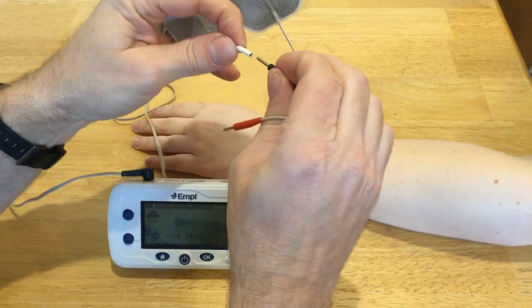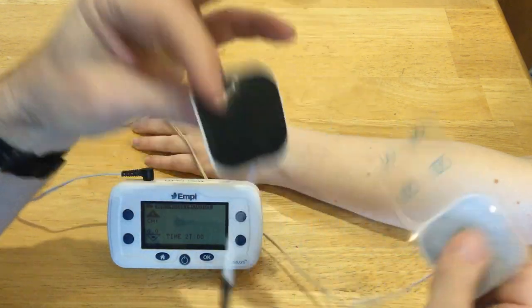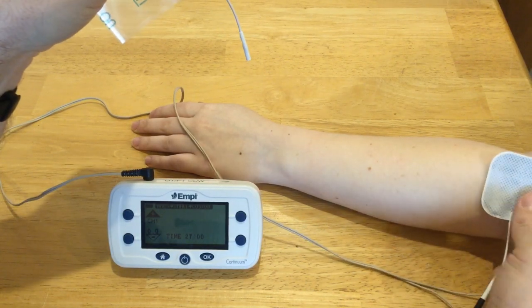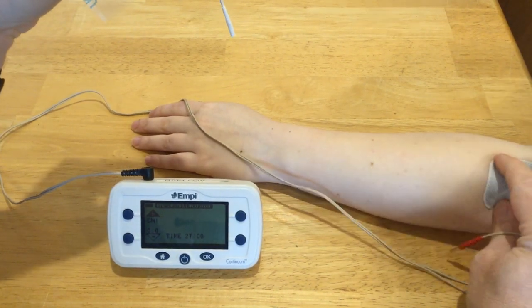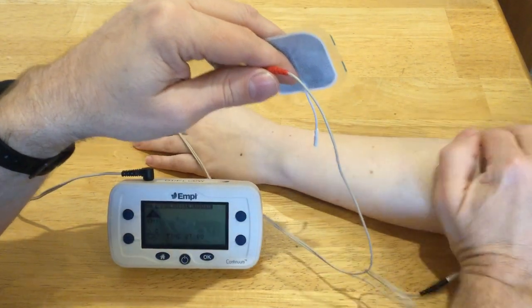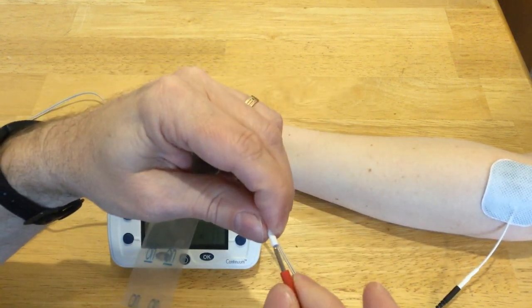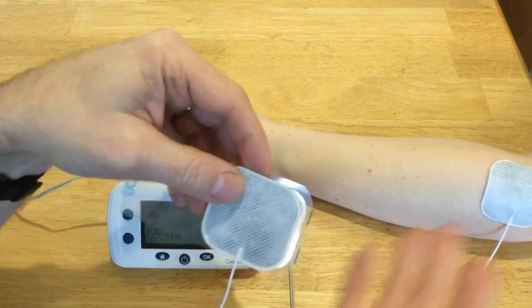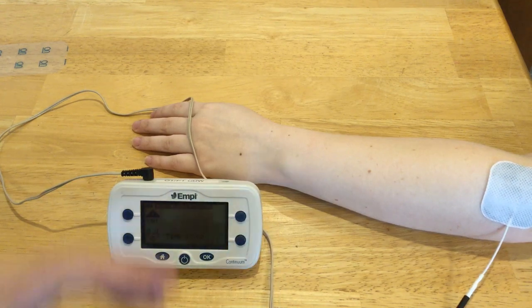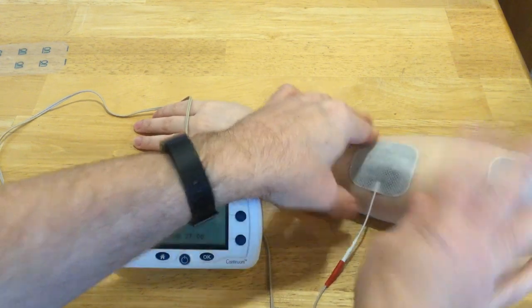I'm going to target the extensor carpi radialis brevis and maybe longus, so I'm going to put the electrode right about where I think that will be. If you don't remember your anatomy, go ahead and pull out your anatomy book to find the location of those muscles — basically you want the electrode over the center of the muscle. There are also motor point charts you can use to help determine electrode placement.